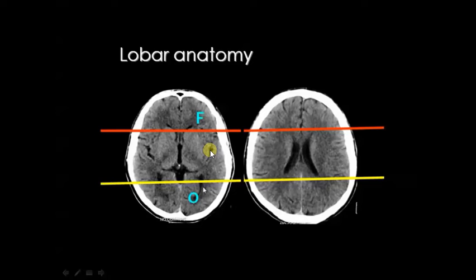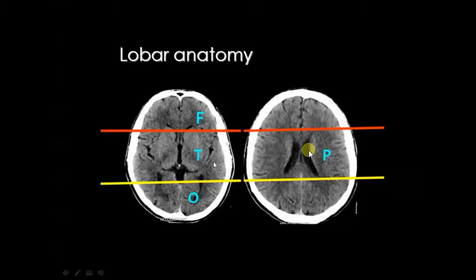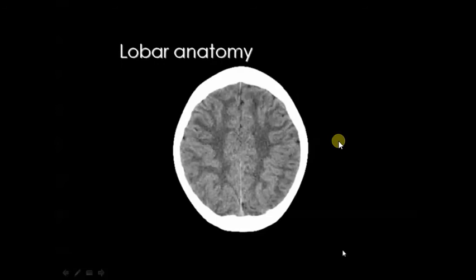If we make a demarcation line, above the demarcation line you can find the frontal lobe. Behind the quadrigeminal area you can find the occipital lobe — this is not the cerebellum, because the cerebellum is below, infratentorial. So it is above the cerebellum — you can see here is the occipital area. In the middle you can see the temporal lobe, but above this area you can see the parietal lobe. How can you tell if it is parietal or temporal? You can see the third ventricle — a little bit below — so it is the temporal lobe. If there is the lateral ventricle, it is the upper area, so it is the parietal lobe.